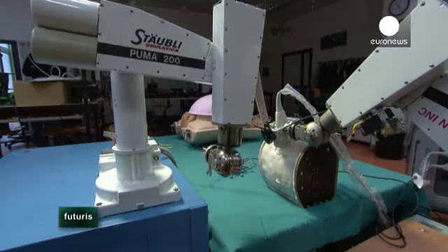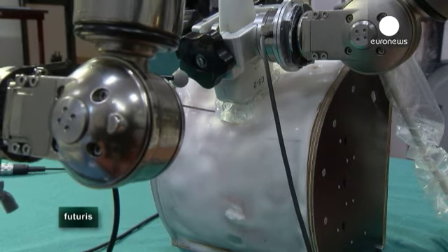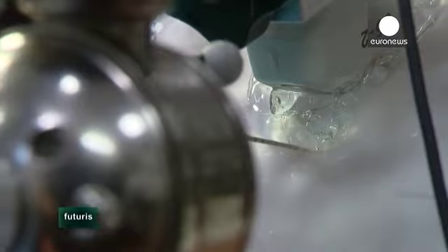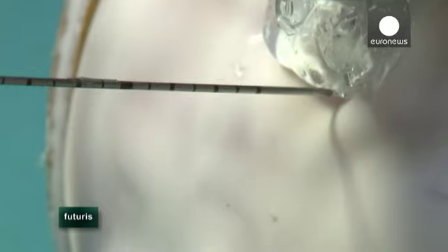This robotic arm is being developed to puncture this model of a human abdomen on its own in search of a tumour in the kidney. Researchers had to translate surgical techniques into numbers that were then transferred into the robot's mechanical and software features.